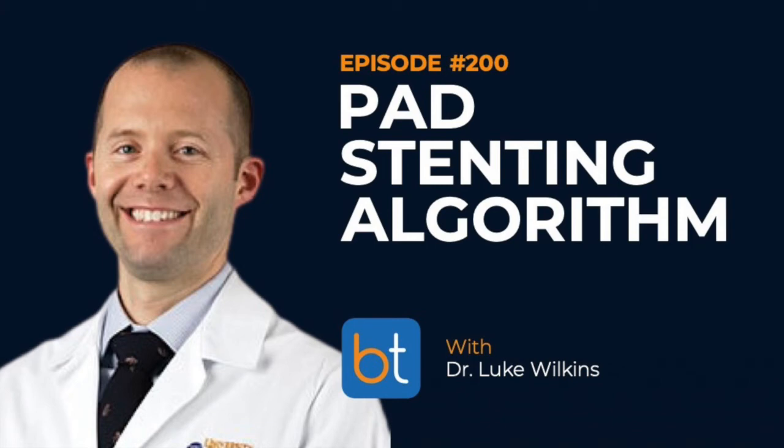There was the Schneider paper in 2019 in the Journal of the American College of Cardiology. There was Ido Weinberg's paper in JAMA Cardiology in 2019. And there's another paper in the European Heart Journal in 2020 that I think can help put endovascular proceduralists who treat peripheral arterial disease at ease about using drug-eluting technologies. In addition, given some of the data released recently with drug-eluting stents, I think they have shown clear superiority in a variety of conditions. And that's where I try to put them into the algorithm.